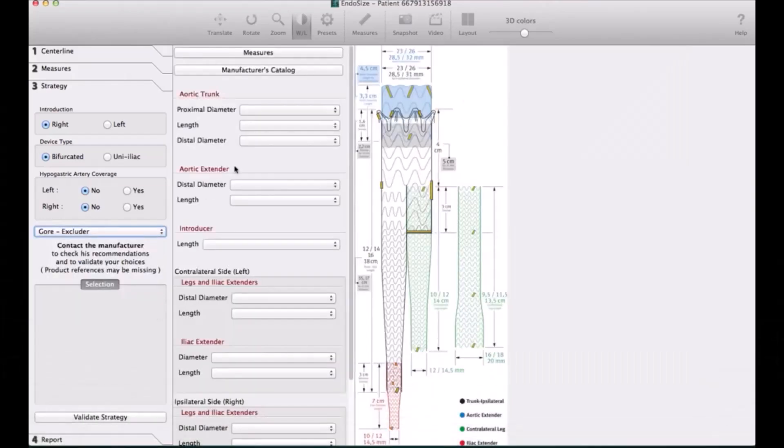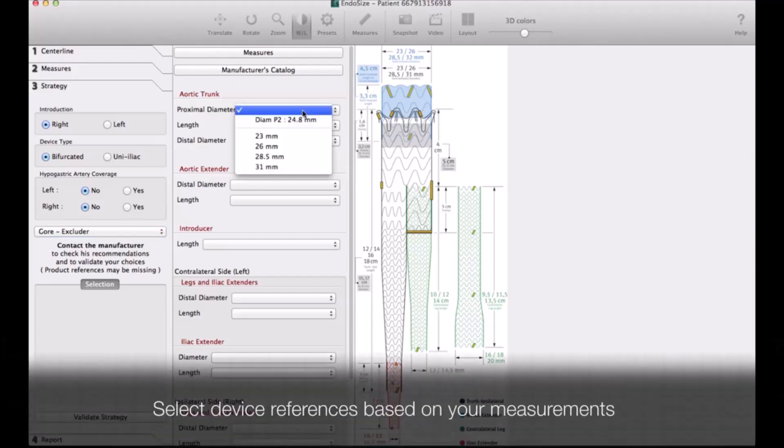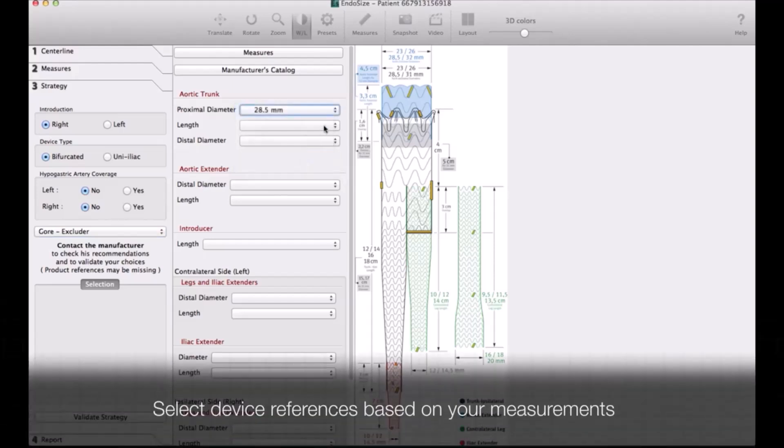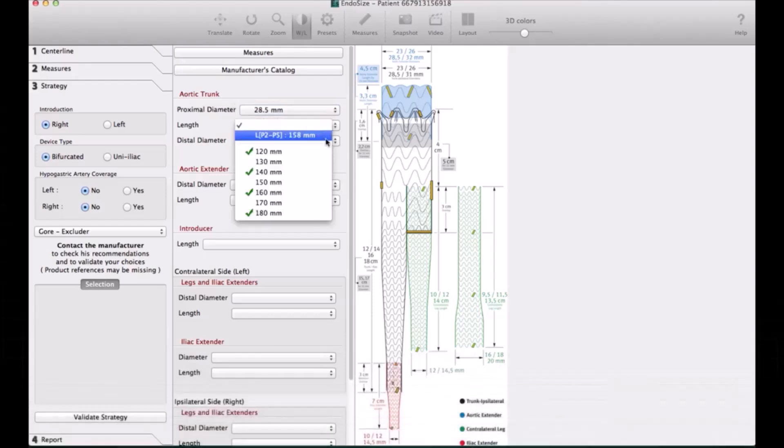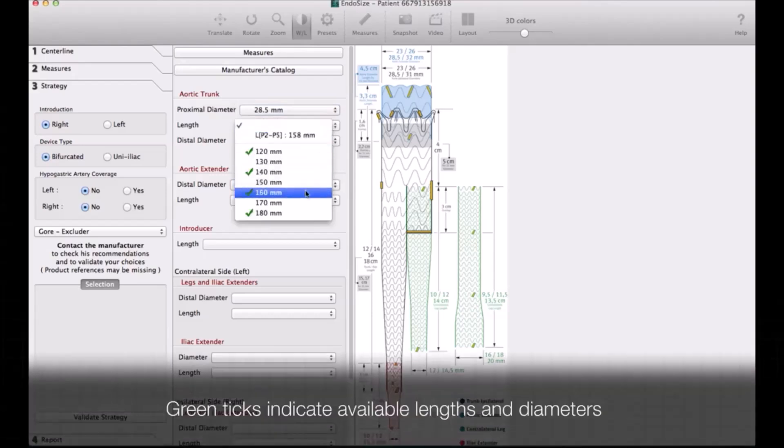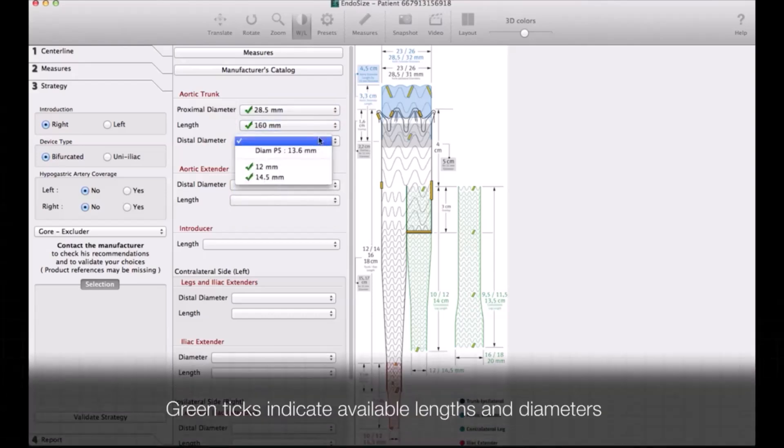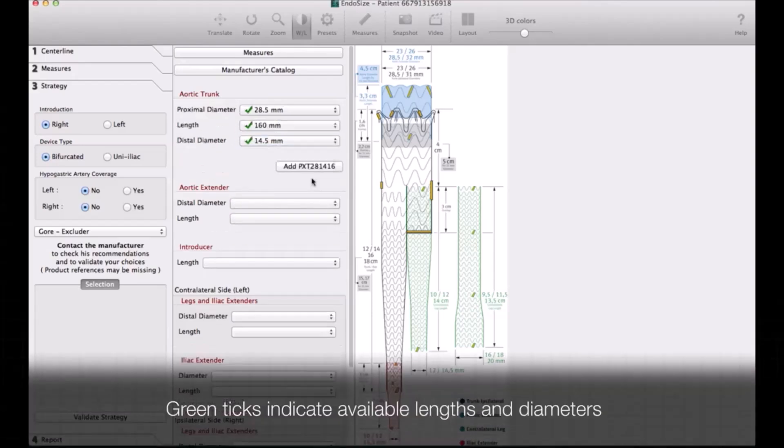All the measurements are being done. Once you select which device you want to use and from which side you want to go in, it will give you the exact reference number of the device that you are going to use, which is extremely helpful.